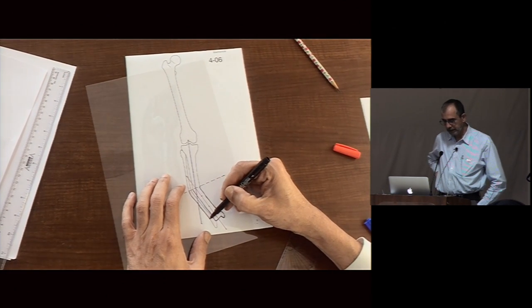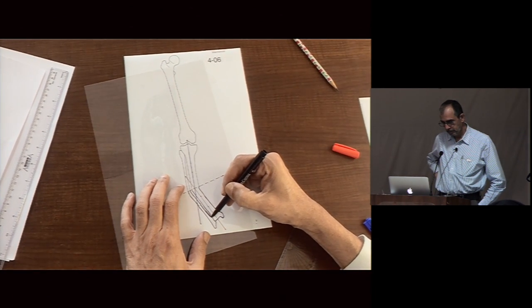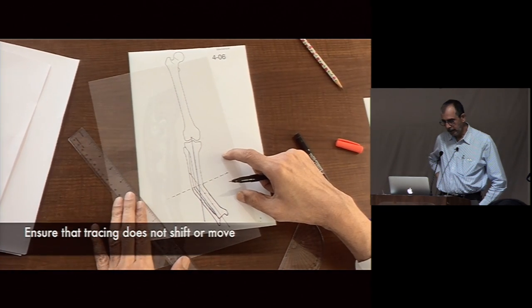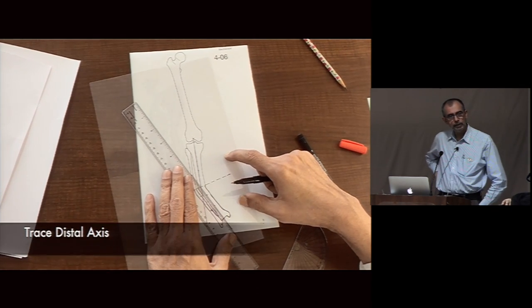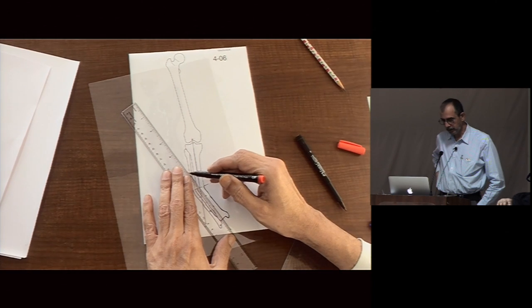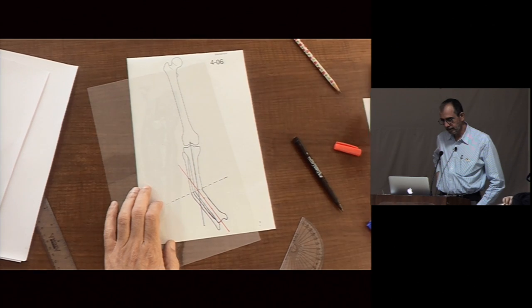Okay, so I am tracing out the tibia as well as the fibula, and I am also putting in the axis. So now on the OHP I have only drawn the distal fragment. I like to use different colors so that things are clear.